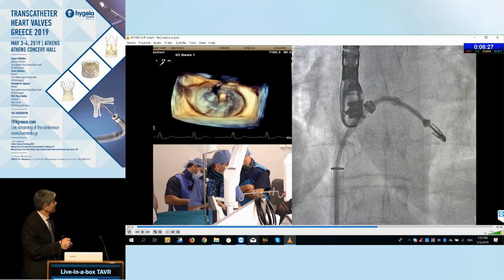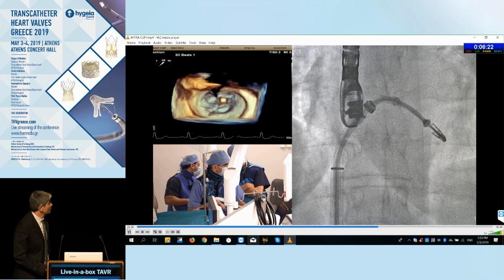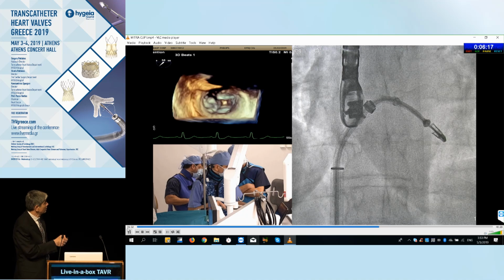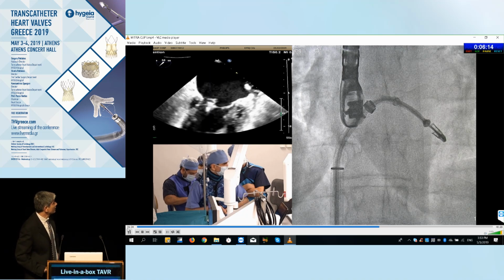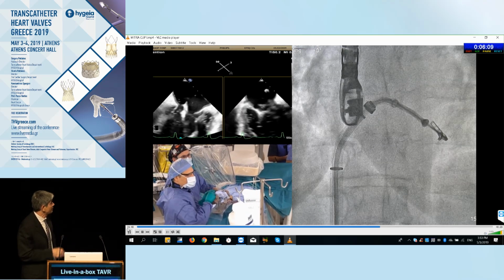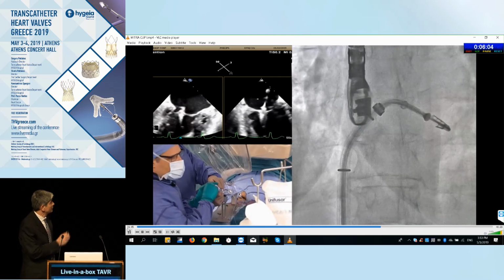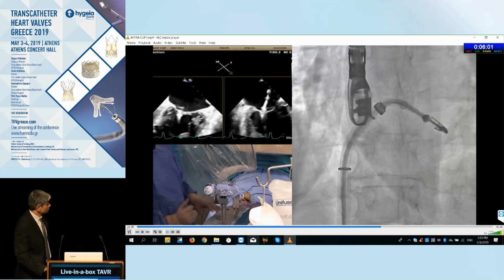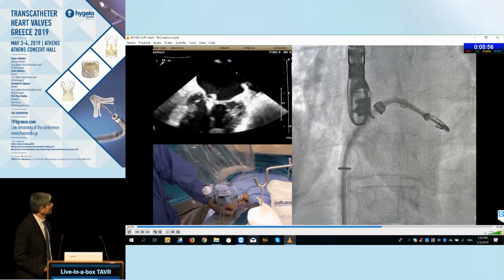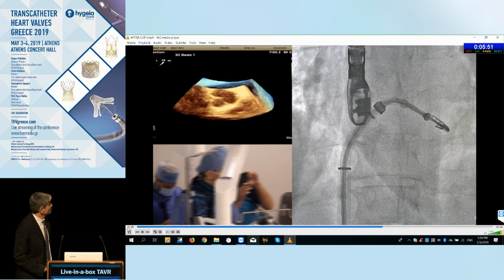And here we're evaluating this again. As a tissue bridge, it looks okay, but we were concerned about the color that was coming from this medial side. So maybe bringing the device a bit more vertical would be what the patient needed. So here we've opened up the device and we do a second grasp in an area that's near the previous one, but we've rotated the device a bit more clockwise. And now we'll see the color that we have in the tissue bridge that we've created.